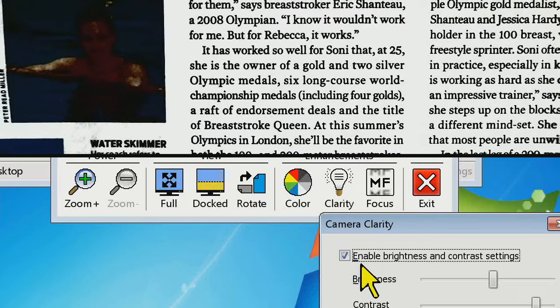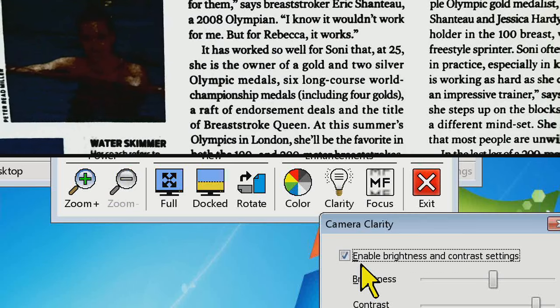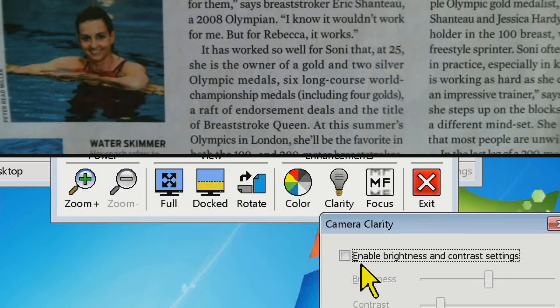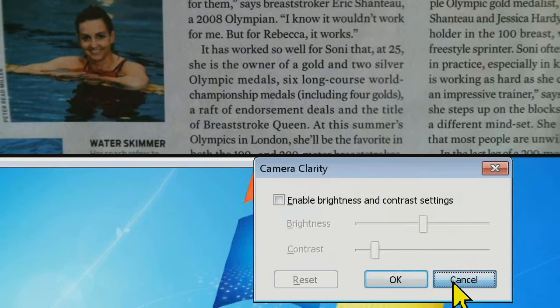So, you know, you could be using it to read your text, okay, and I'll zoom out. Now I want to see what that picture is. Just hit Alt-Windows key C, and that will bring it back to the normal brightness and contrast settings. So very important control, also important to understand when and where to use it. Use it when you're reading text. Turn it off when you're viewing something like images. Okay, and that can really help.